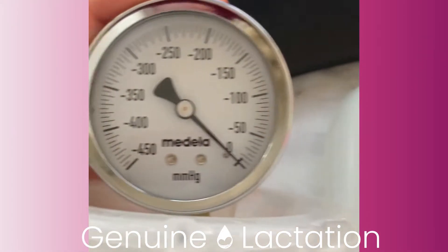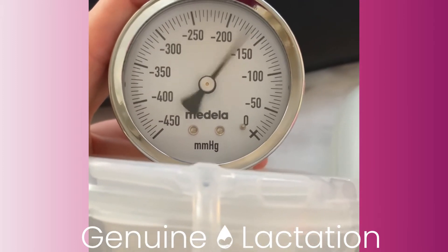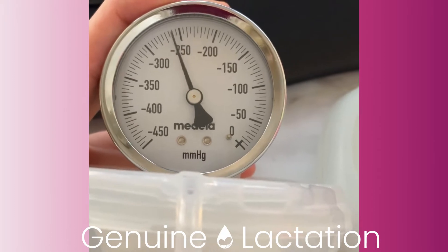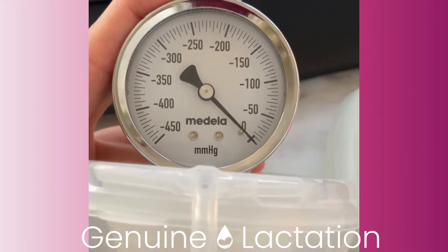This is the LV Stride with the Free Me cups. As you can see, it gets up to full suction just like the LV Stride cups, but it definitely does not go as high as, say, the Legendary or the Spectre cups.